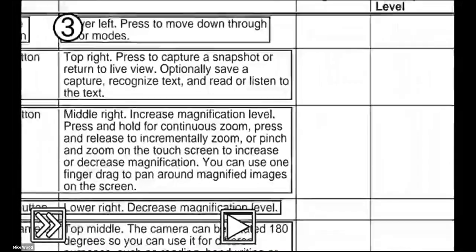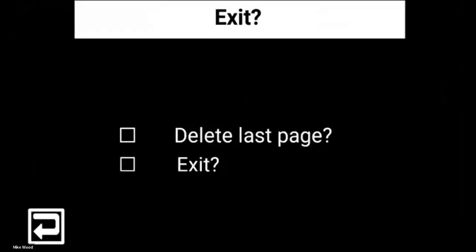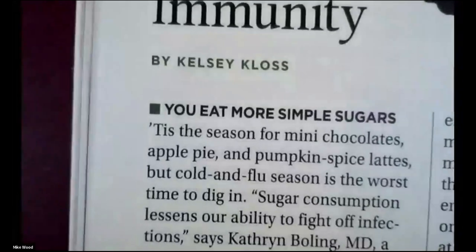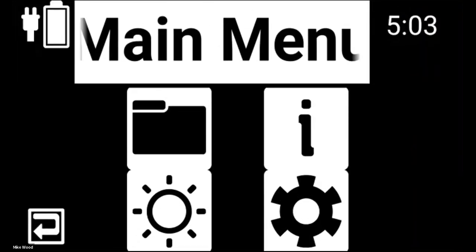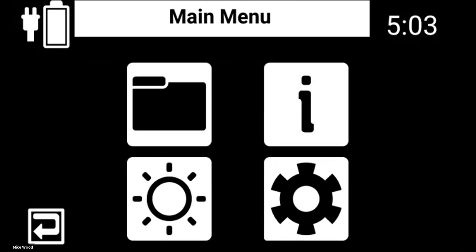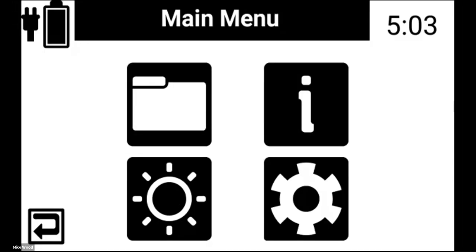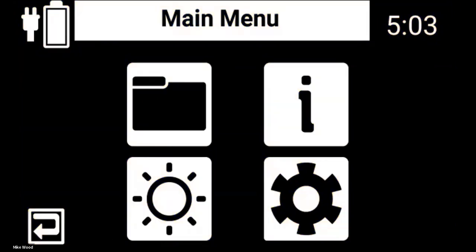You can come into your main menu and press the plus button — the main menu text gets larger. And as Justine showed, you can have high contrast like black text on white background, or switch to white text on black, or black on yellow, and customize how the menu looks as well. Great question with the font sizes.